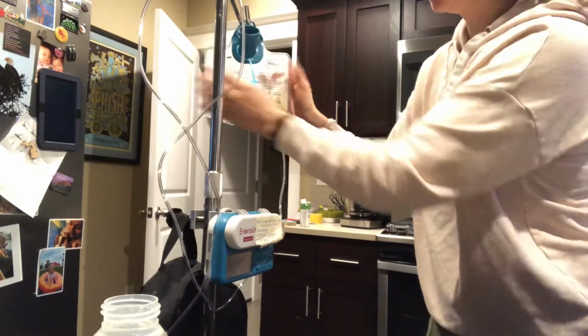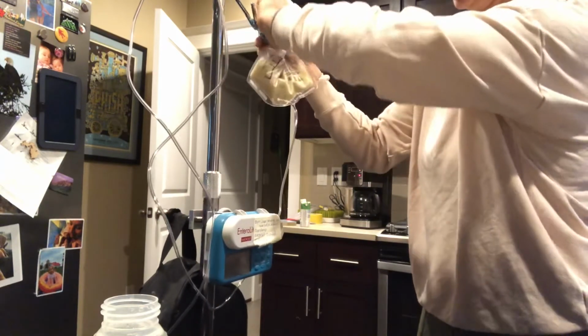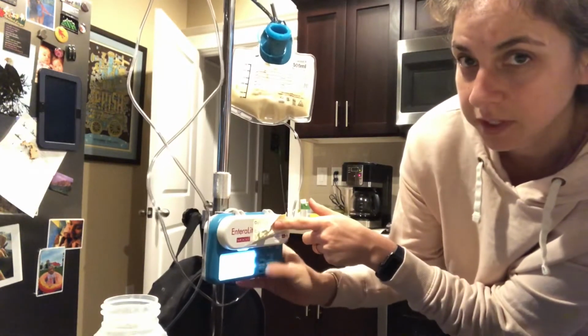Then what you're going to want to do is make sure that you just kind of press the air out of the bag and put the lid on. Turn the pump on. There's just an on button on the top left here.